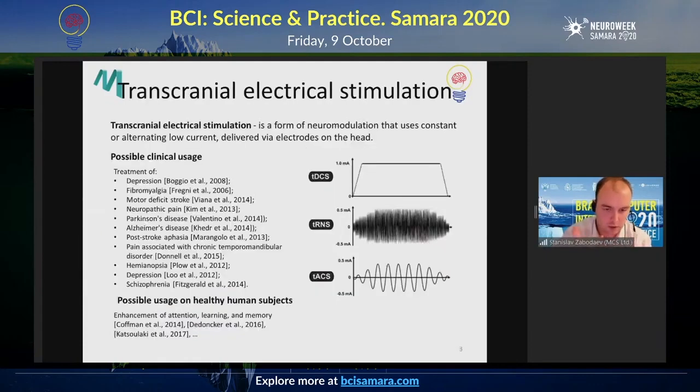And if we look at the previous slide here, on the whole, electric stimulations, and it's DC stimulations using direct current. That's when we have one cathode and one anode, and the current doesn't change during the procedure.